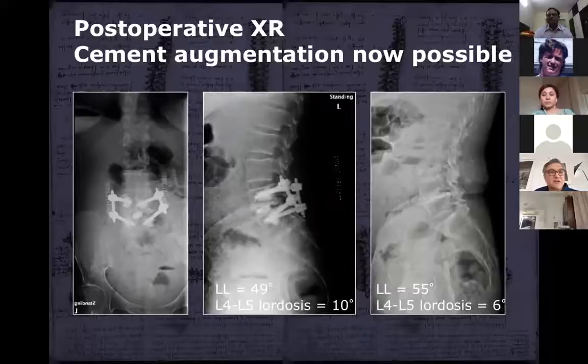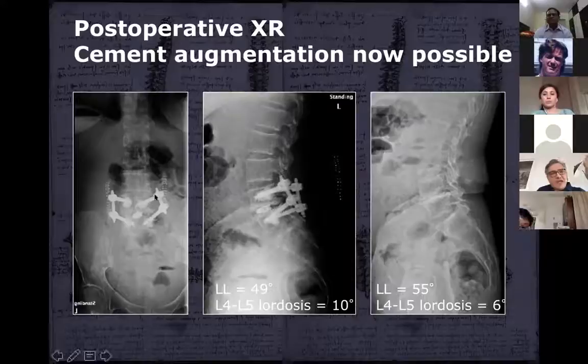There are some pedicle screw systems available. In the US, that was a big deal to get the pedicle screws that are actually suitable and FDA approved for cement injection. Now they're available. I know in Europe and Asia, you've had those for a long time.